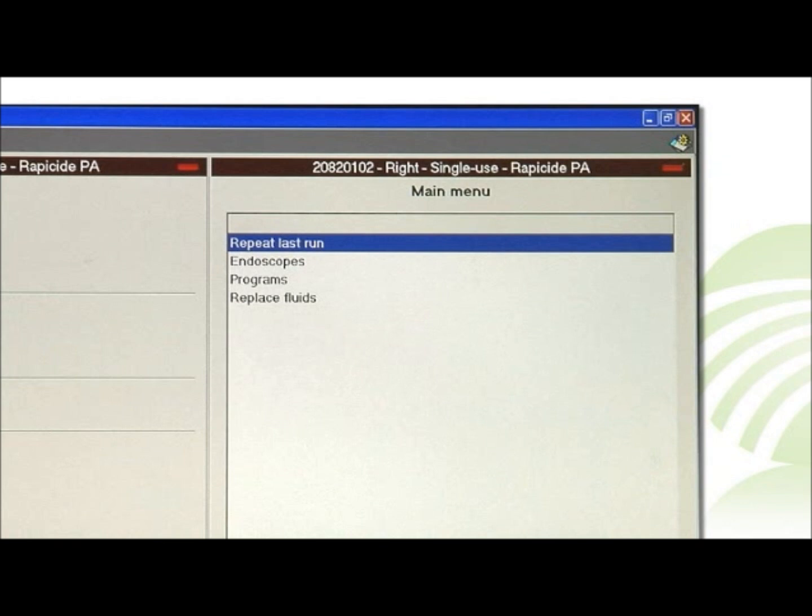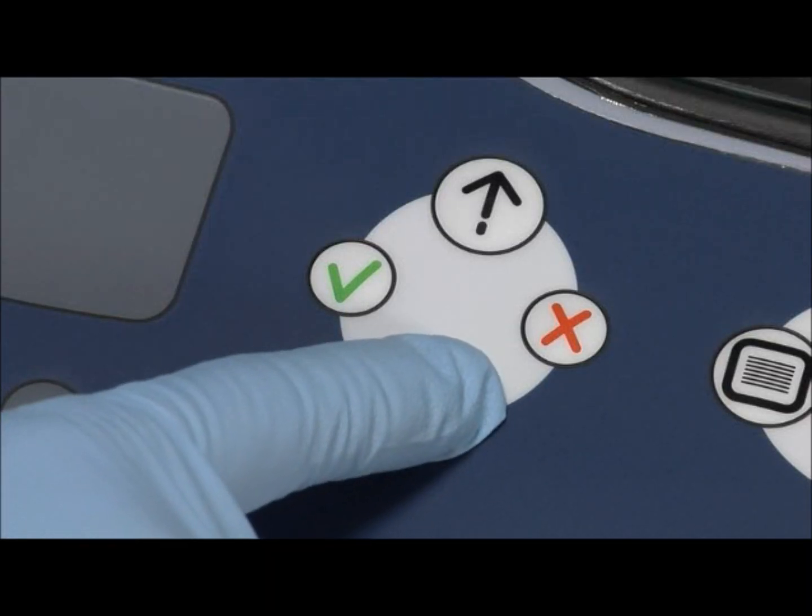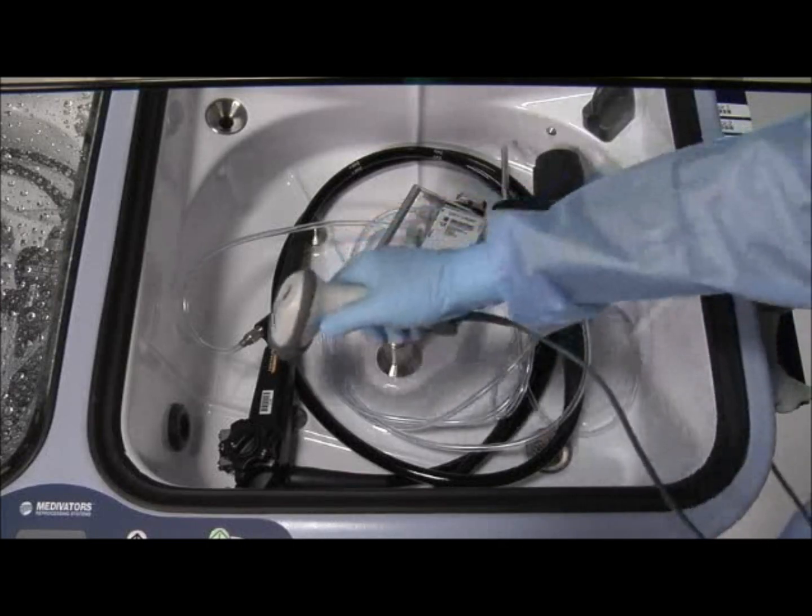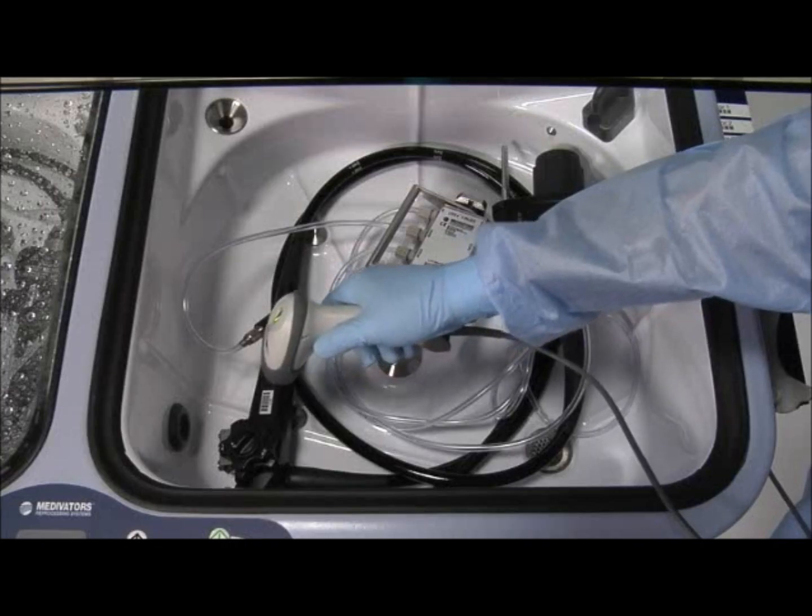The program selection window opens. Use the scroll down button to highlight endoscope selection and press enter. Use the barcode scanner to scan the barcode found on the endoscope.